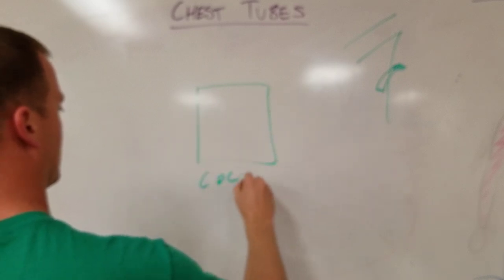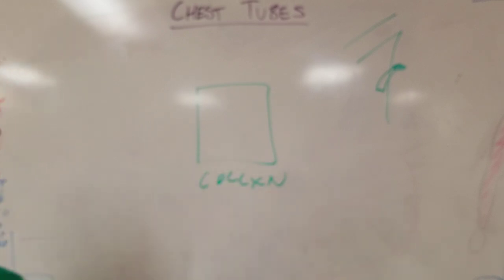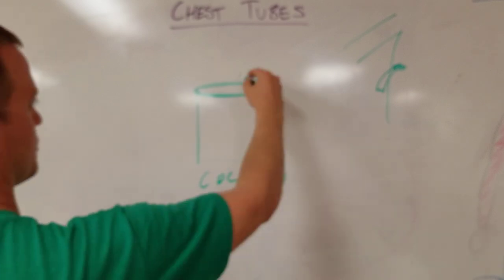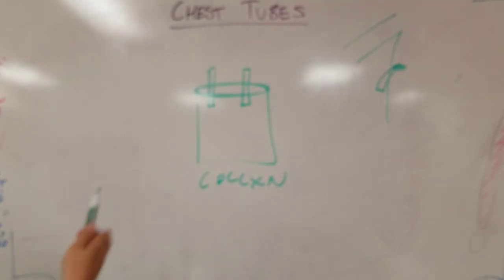Okay, collection. And now all that this is, imagine this is a glass jar and it has a cork on the top. The only reason why it's a cork is because it makes it airtight and it sounds old-timey, which is when this was invented. It has two small glass pipettes going through the cork, it's airtight, etc.